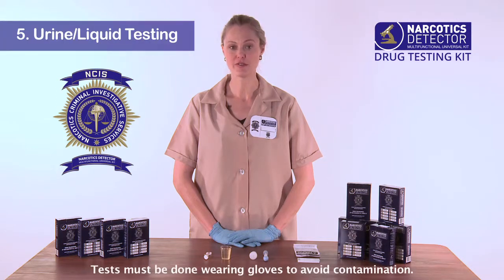The testing of fluids or liquids. For the testing of bodily fluids, just know that you need to have permission from the person. Regarding the legalities, you need to know that when testing bodily fluids, it needs to be observed. Testing of bodily fluids will include blood, urine and saliva.